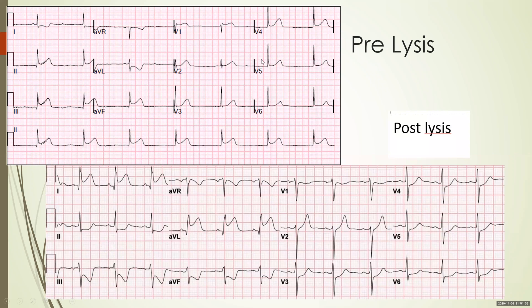So pre-lysis, you have an inferior wall MI with ST elevations in the inferior leads. Post-lysis, the ST elevations in the inferior leads have disappeared and instead you now have ST elevations in the high lateral leads — a high lateral wall MI. Pre-lysis: inferior wall MI. Post-lysis: lateral wall MI.